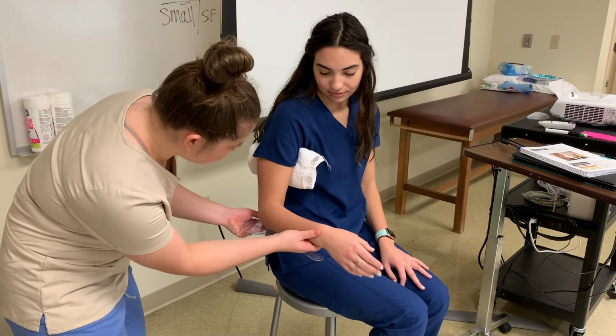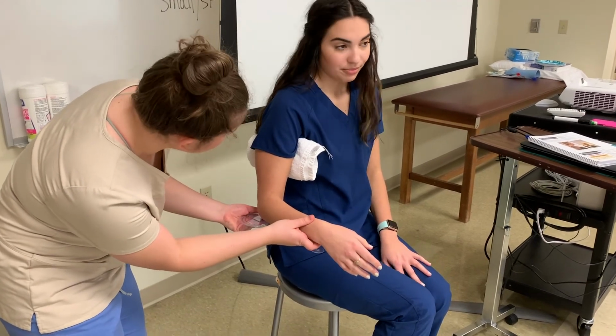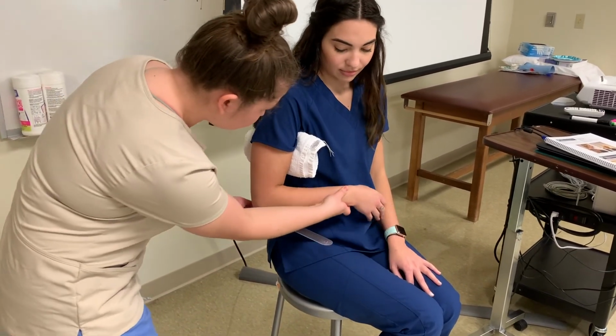For passive range of motion, you do the same measures but instruct the client to be fully relaxed and the therapist will move them through the motion.